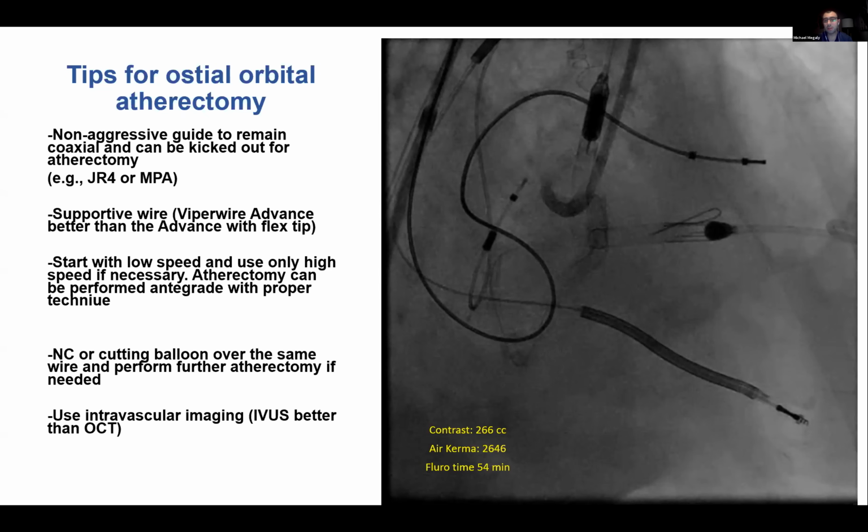I would say that it's still very tough to deliver in very severely calcified lesions. You might need to make room for it, but I highly doubt that it could have been delivered in this case, especially with basically no guide support and a very ostial lesion, severe calcification. So it works pretty well, but I'm not sure of the applicability in this case. So what do you think? Do you think it would have crossed?